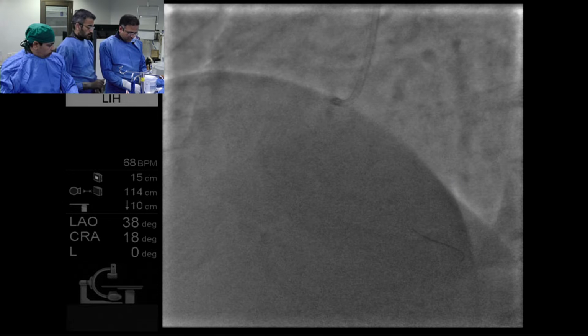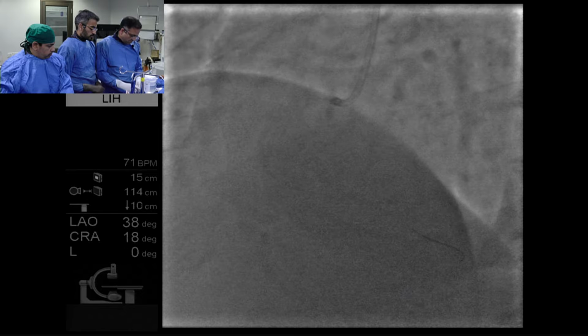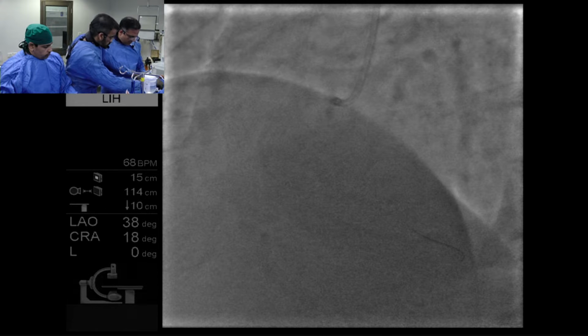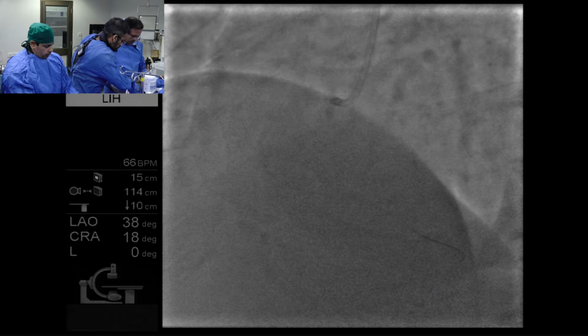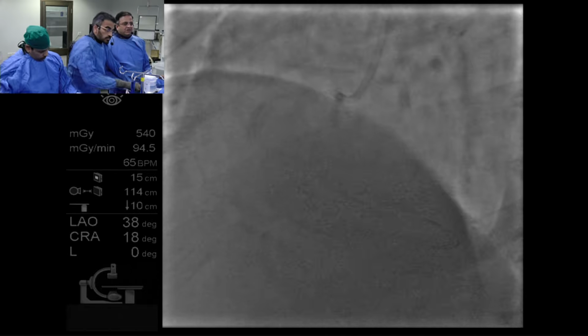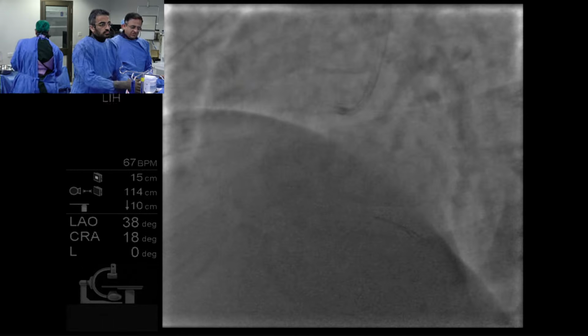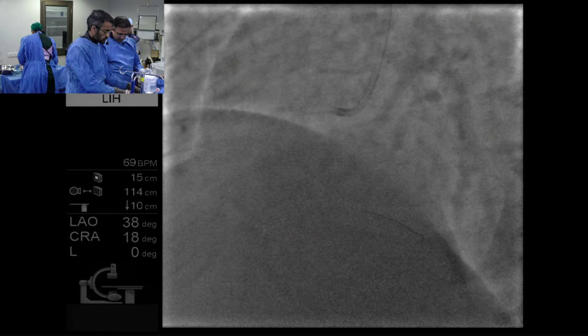Just one second. Ready? Good. Okay. And there. Okay. Ready? Let's take a nice picture here. Ready? Yeah.